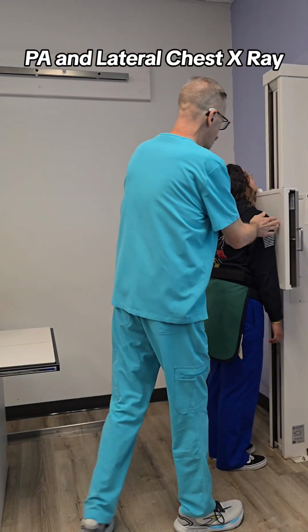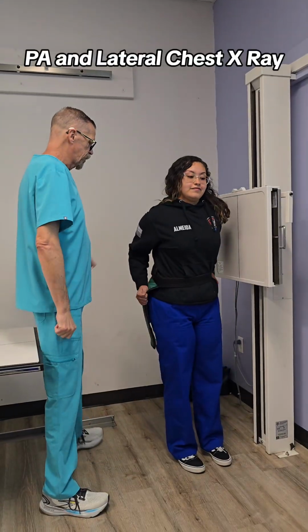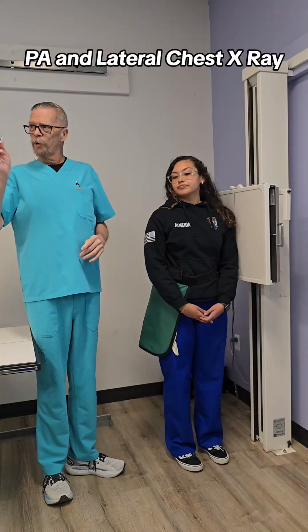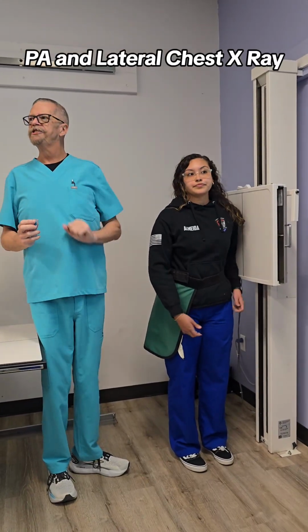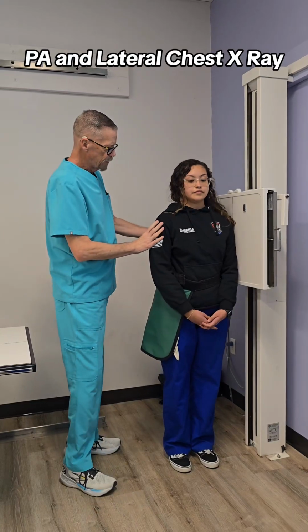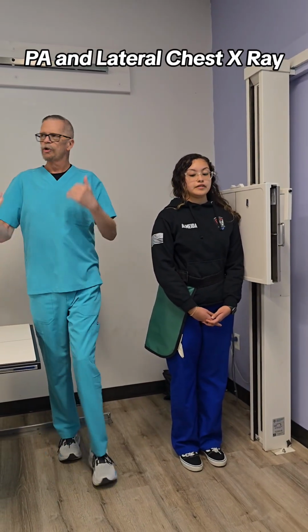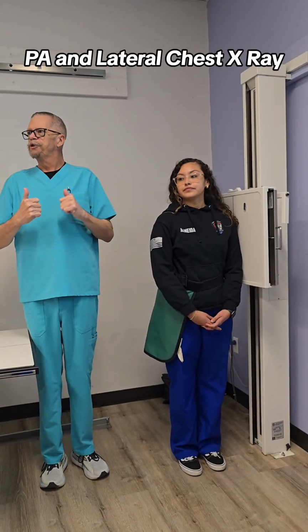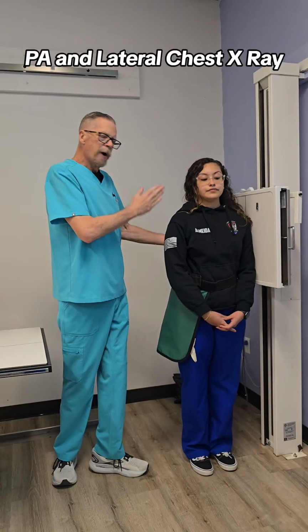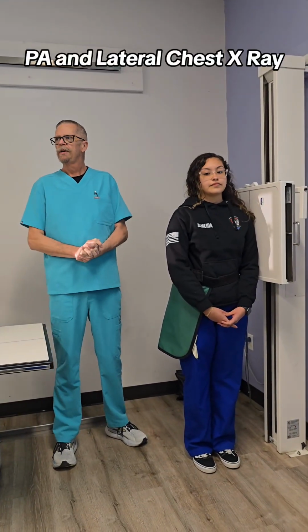All right, so we're going to have you turn facing this way, and let's spin the shield around so it covers this side. We're going to leave a left marker, but we always want to have the marker on laterals anterior. So I'm going to place the marker right here. Step up again. I should not need to adjust my image receptor. She didn't grow or shrink when I went from a PA to a lateral, right? Patient's the same size.